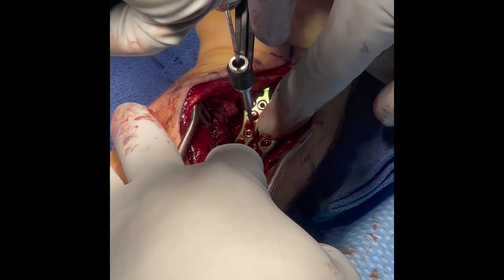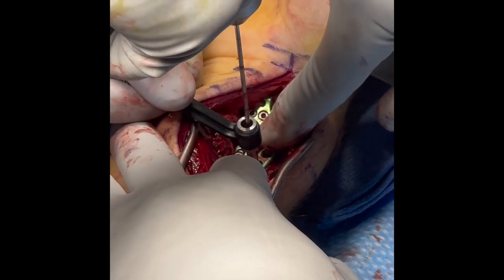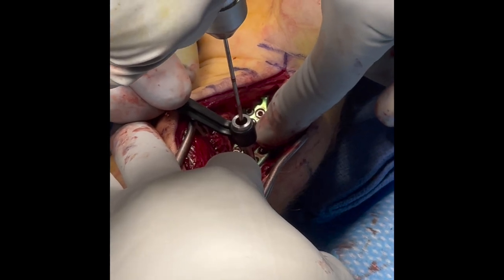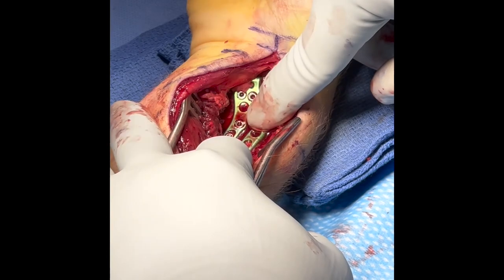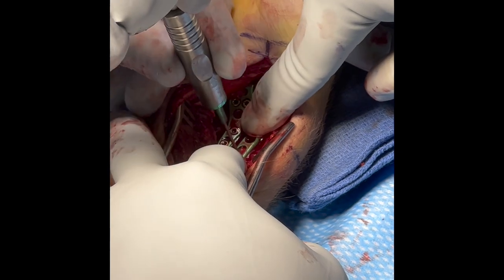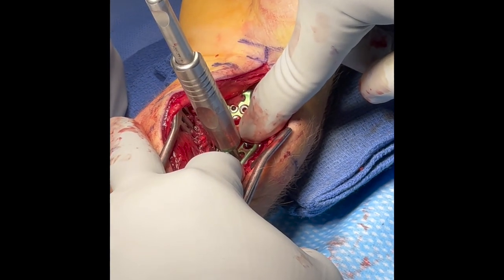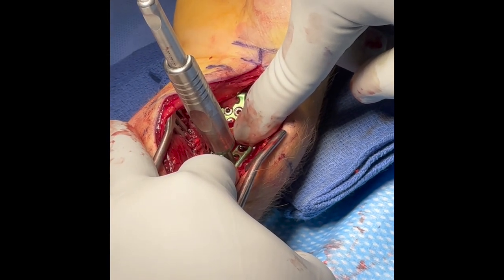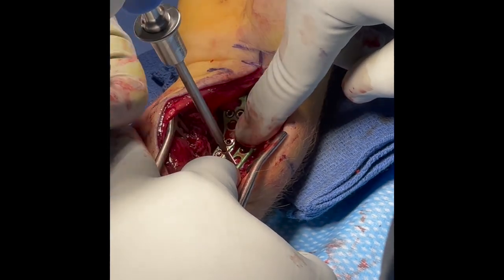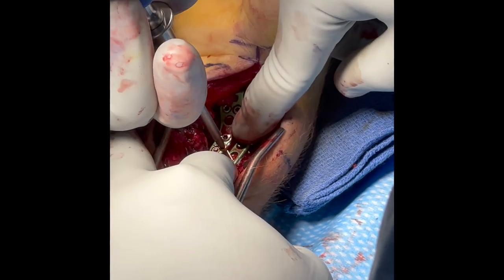As before, a non-locking screw is placed in the oblong hole. This can be exchanged later for a locking screw if desired. The locking screw will lock into the plate with the NuClip technology.